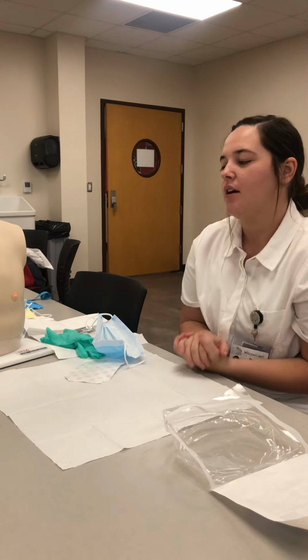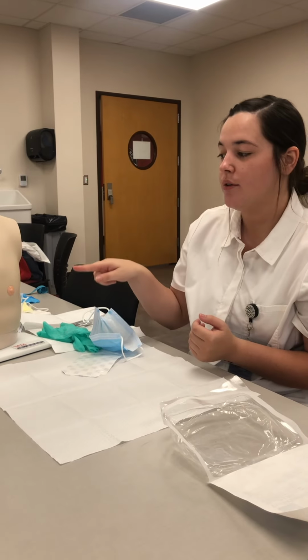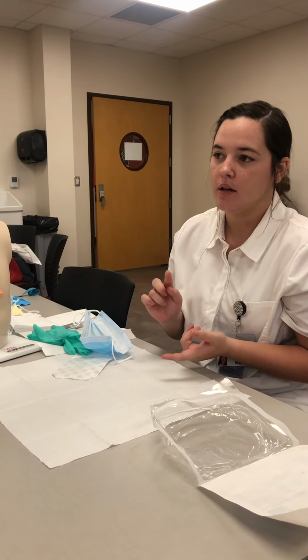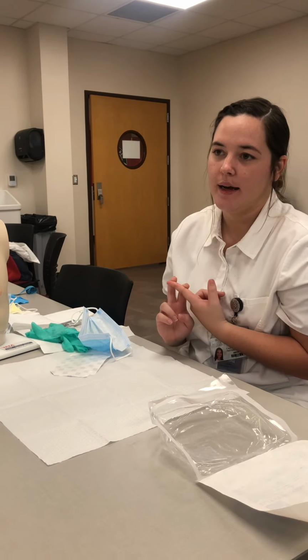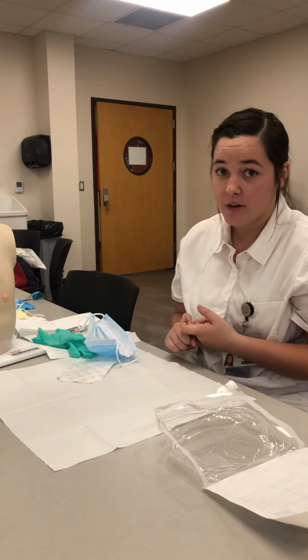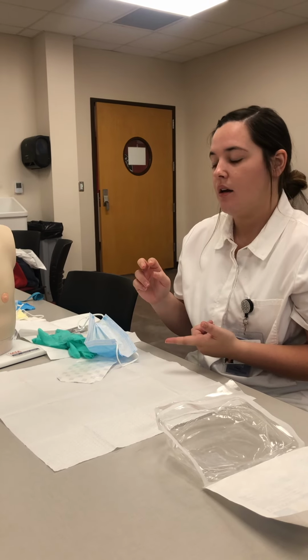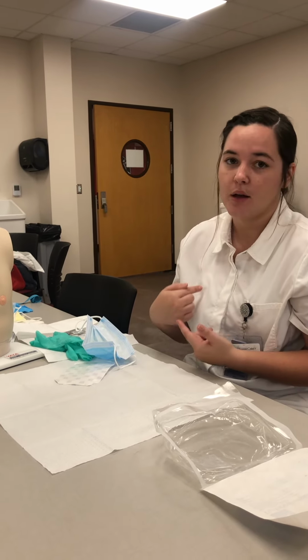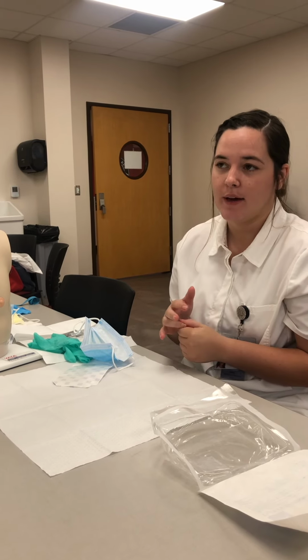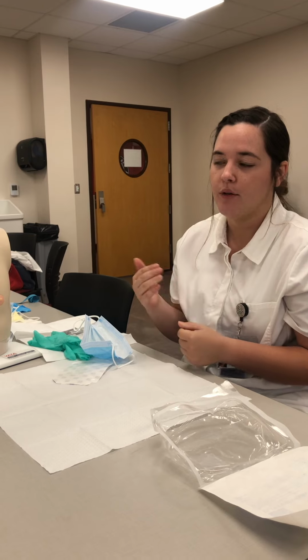And now we're going to label the dressing with our initials, the time, date, and how the patient tolerated it. We're going to document how the patient tolerated it, the time, the date, where it's located, and the assessment findings that we had of how the wound looked.